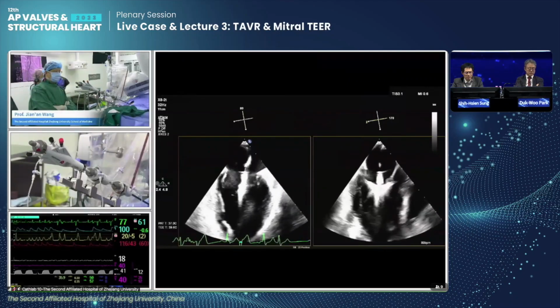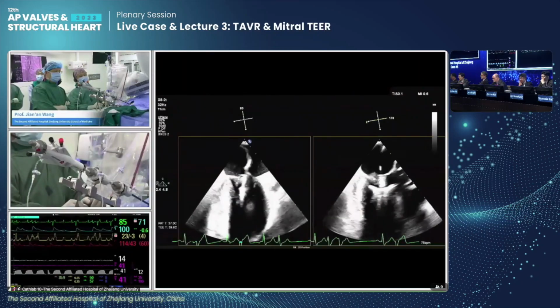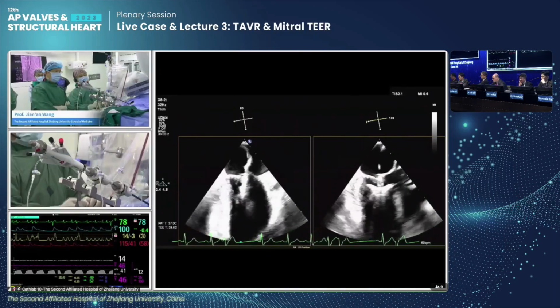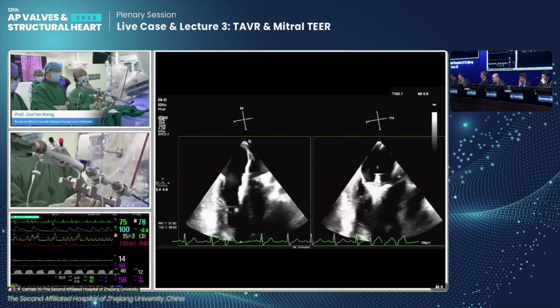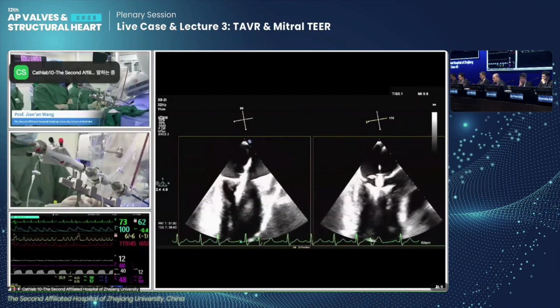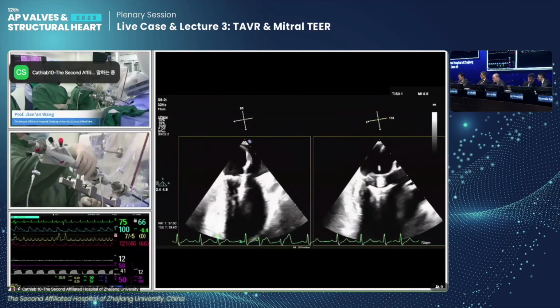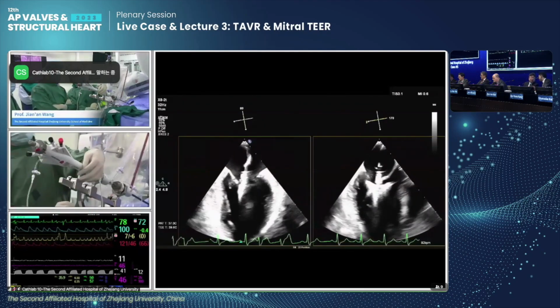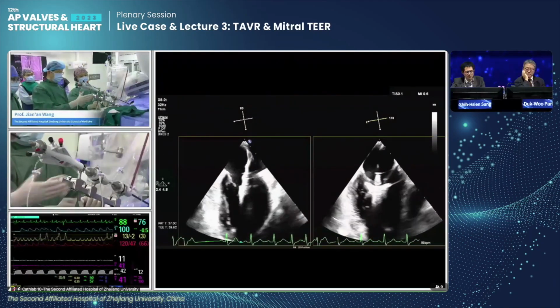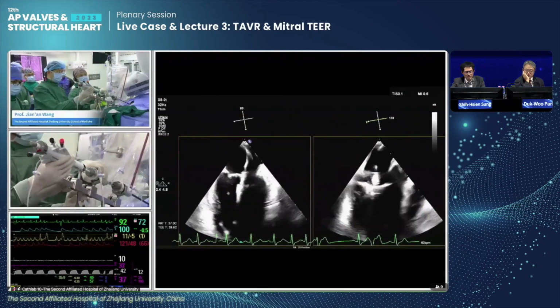Well, you're over a big flail there. Right side. Okay, the posterior is intermittently falling in. What is your comments about the alignment and about the position? Do we need more medial or more lateral? I think you can pull back, given that your clip is a bit medial dive trajectory. So you can pull back.